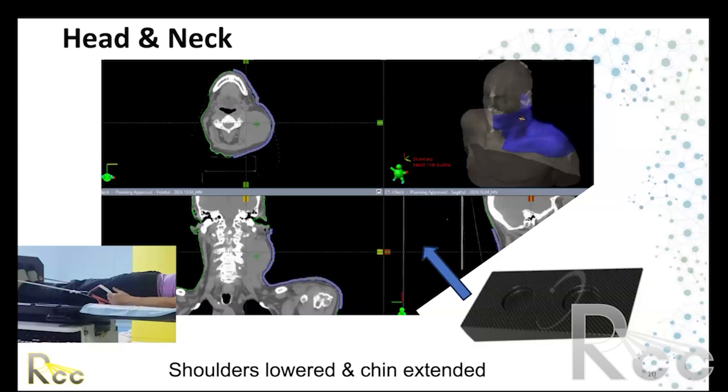Okay, thank you. However, in the treatment planning system, the tools are not quite sophisticated enough to design a bolus in a very intelligent way, which would just cover the superficial disease and not expand more broadly. Now, there are ways to trim down the bolus, there are ways to tighten it down, but if the treatment planner is in a hurry and they have many, many cases to do, it may be that they design a bolus that's just simply not physically realistic. And that's what I'm showing here. Any other questions regarding virtual bolus?